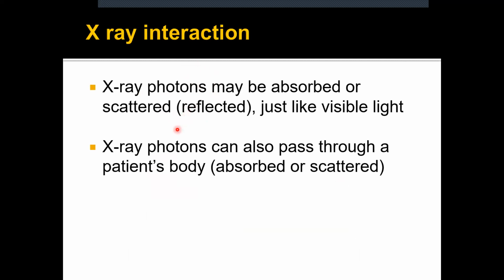Once your X-rays have left the anode, different things can happen to them as they travel through the body. Right? Just like visible light, they can be absorbed and they can be reflected.